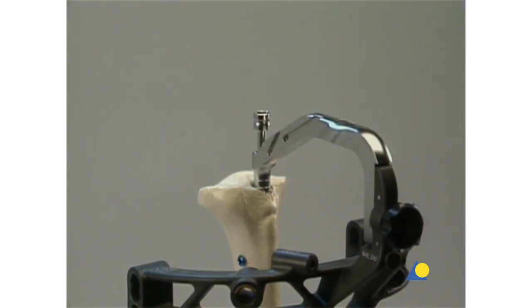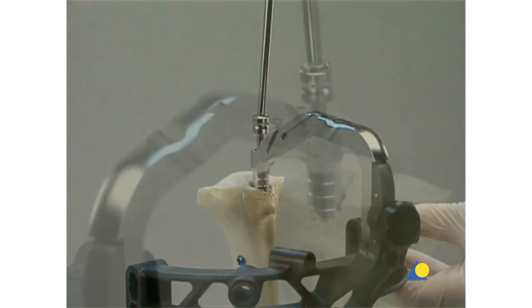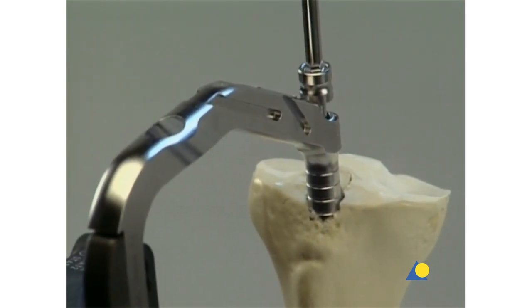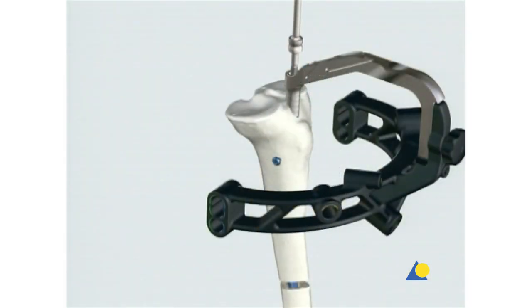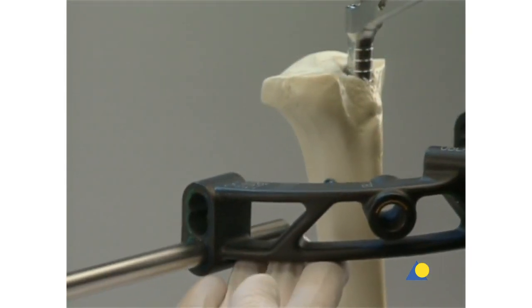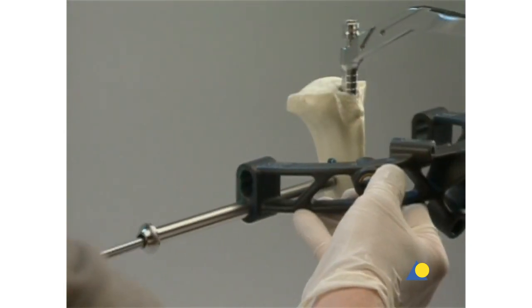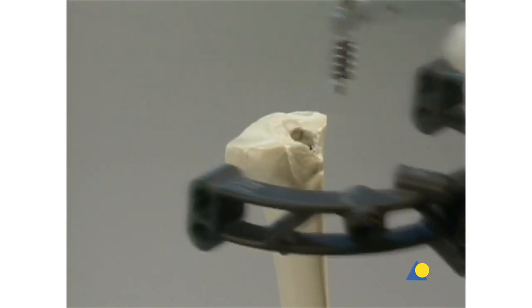At this point in the procedure, the expert tibial nail has been locked distally, and one proximal locking screw has been introduced in the dynamic locking option marked DYNAM. This type of locking does not allow secondary dynamization. The fracture gap is continuously checked before, during, and after the compression procedure. The second proximal locking screw is introduced into the most distal hole of the proximal locking options marked STAT 1. The compression screw is then removed with the screwdriver.